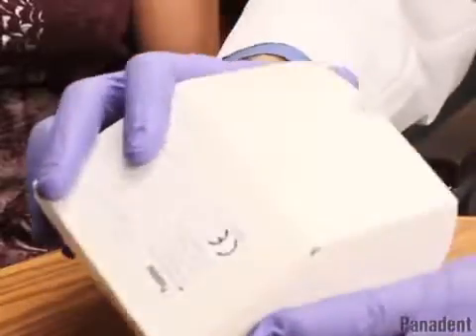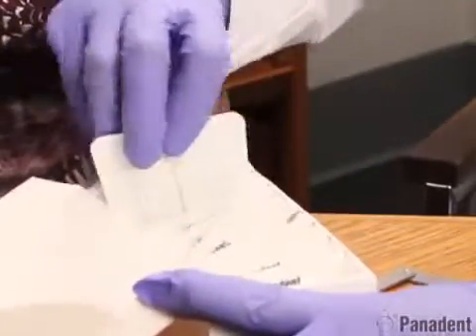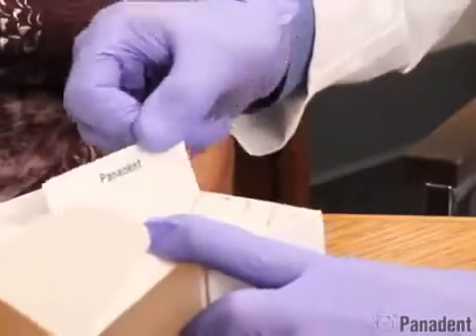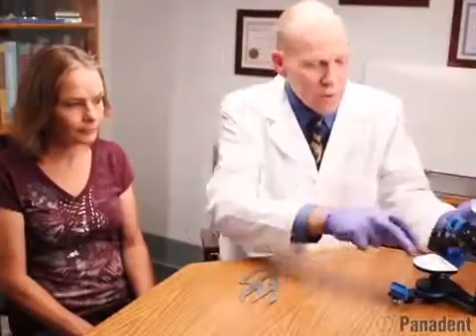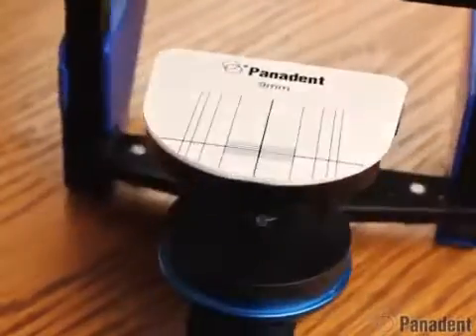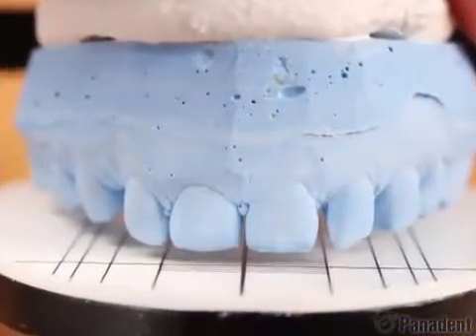And we have a set of golden proportion waxing guides from 7 millimeters up to 10 millimeters in half millimeter increments. So we can choose the 9 millimeter golden proportion waxing guide, come to the Kois platform, add the waxing guide to this, and we can now evaluate tooth lengths as well as tooth widths all at the same time.